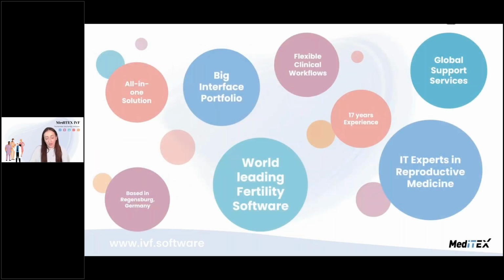About MedITEX, about the company behind MedITEX, which is called Crytex. We are based in Germany, in Regensburg. We are known as IT experts in reproductive medicine and are currently the world-leading fertility software with over 17 years of experience. MedITEX IVF is provided with flexible clinical workflows. That means that MedITEX IVF gives you the possibility to adapt your own clinical workflows into the system. We also provide a very big portfolio of different interfaces, providing device connectivity and also integration with different systems.